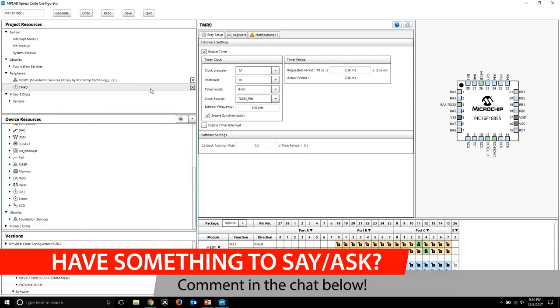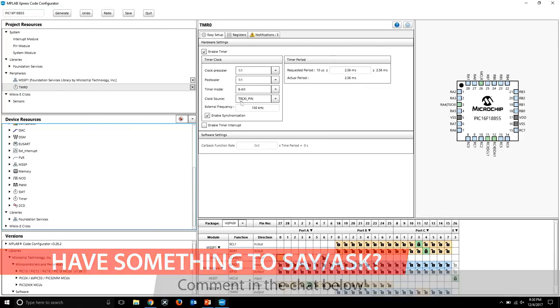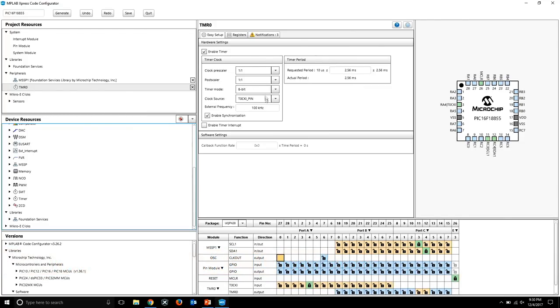And once you double click, it should get added to our project. It'll default to the easy setup window. And they ask for 1 millisecond. That is the number they've given. Now I found that to get the best result, I would actually use a 16-bit mode with a high-frequency internal oscillator. And this actually gives the best resolution possible. Now I'm just going to go to the right and enter one, and then hit enter, and that will round up to the actual period of 1 millisecond.